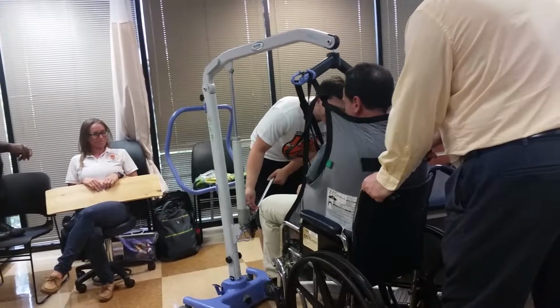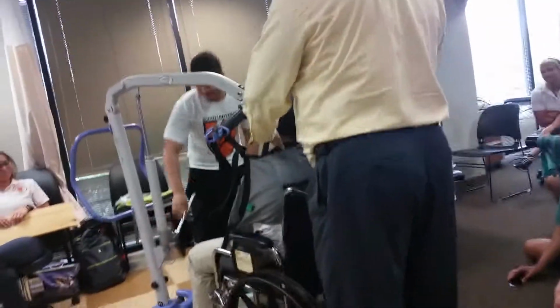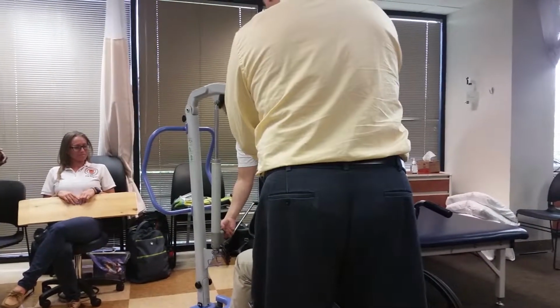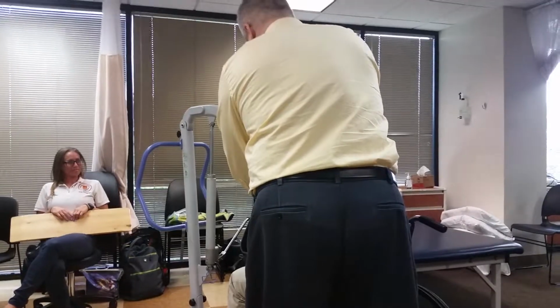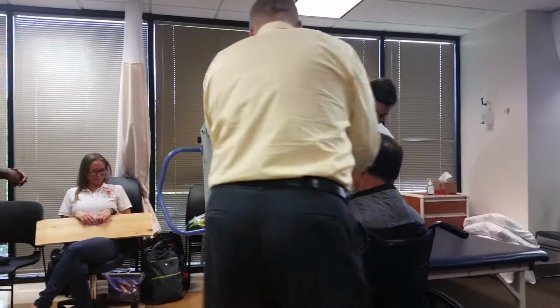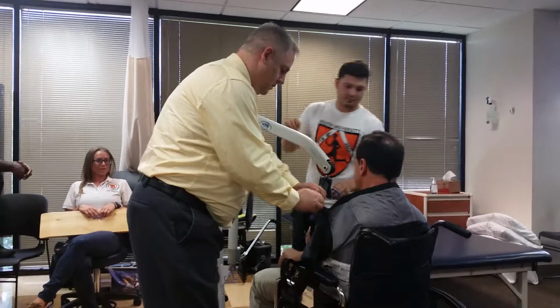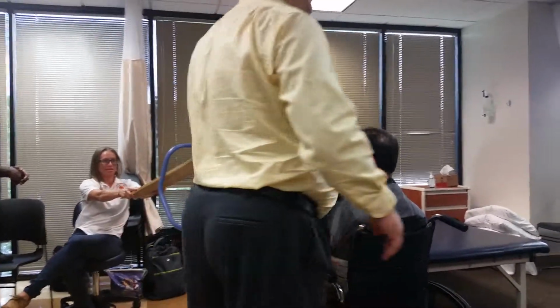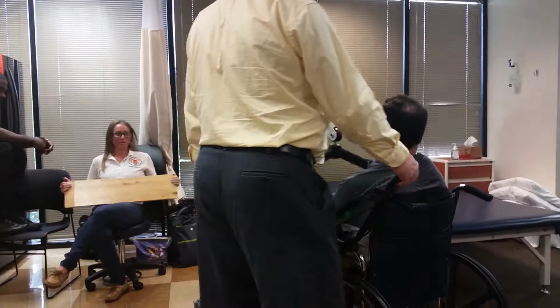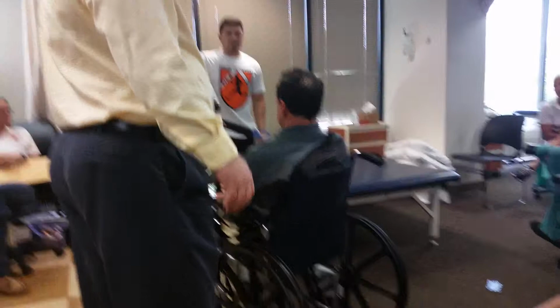There we go. That one's kind of jerky, right? So now in this position, usually it's just automatic, we could remove. This is called a Hoyer lift. You can have the ceiling lifts, like that. Definitely the wrap that he has will be in their room, specific to that room, and then you just leave it. So now we would leave this sling, guys, underneath him.